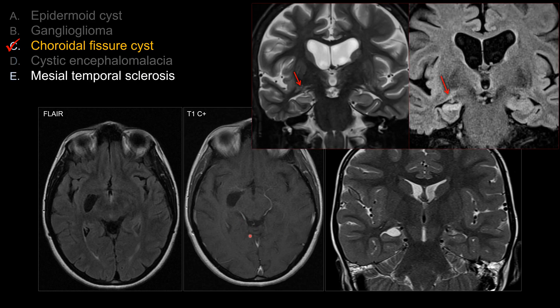Mesiotemporal sclerosis: based on the history of seizure, you do want to look for mesiotemporal sclerosis. At first glance, some people may mistake this for a dilated temporal horn. However, for mesiotemporal sclerosis, you should see at least two of three findings: abnormal signal intensity especially on FLAIR, atrophy of the hippocampus — as seen on this normal comparison side, with clear atrophy often leading to ex-vacuo dilatation of the temporal horn — and loss of internal architecture.